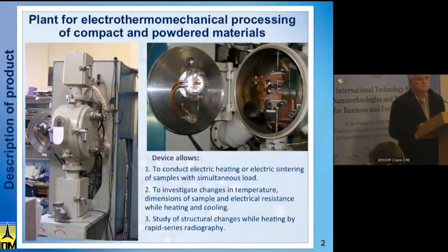And how to increase its efficacy? The first is a slit at the focal point of the X-ray tube, which increases the efficacy dozens or 100 times.